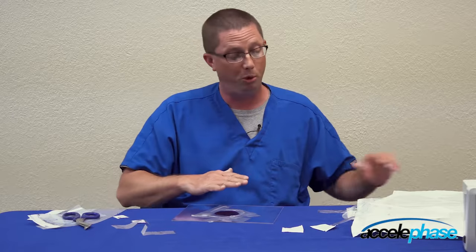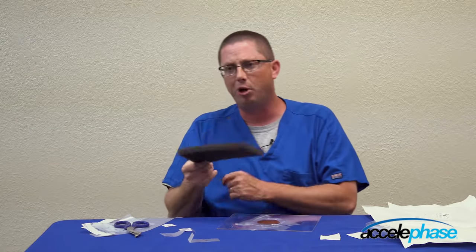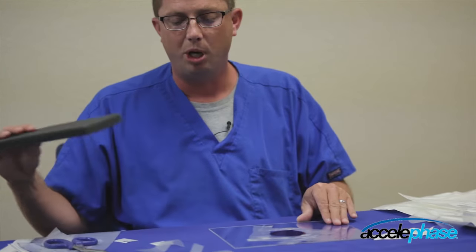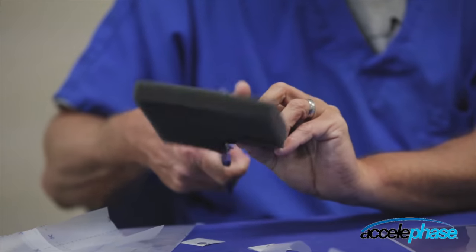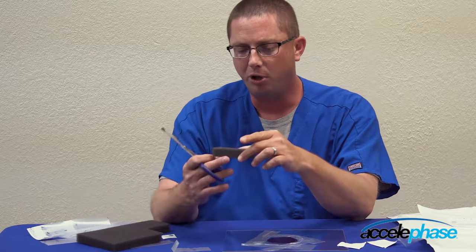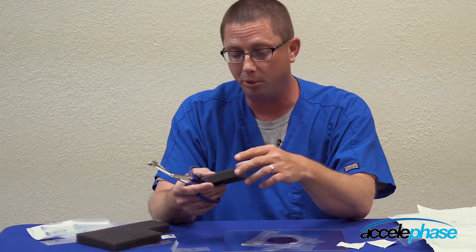So now I have my wound windowpane. I want to apply the foam media for negative pressure. When cutting the foam, you never want to cut the foam above the wound base — debris can fall into the wound, and you should always cut the foam away from the wound base. I usually cut the general size of the foam, and you want to ensure when you cut the foam that it touches the entire wound base. If it's not touching the entire wound base, negative pressure's benefits will not be applied to that area of the wound.